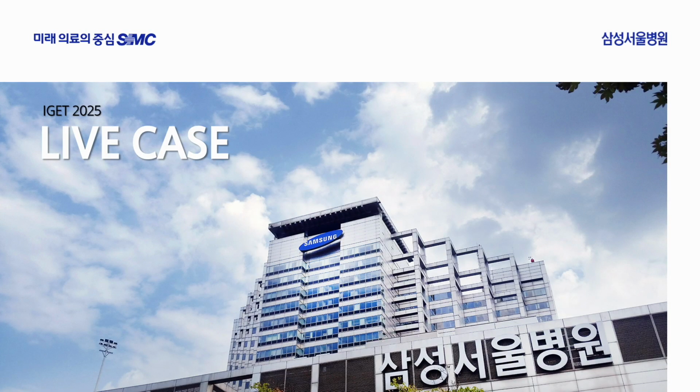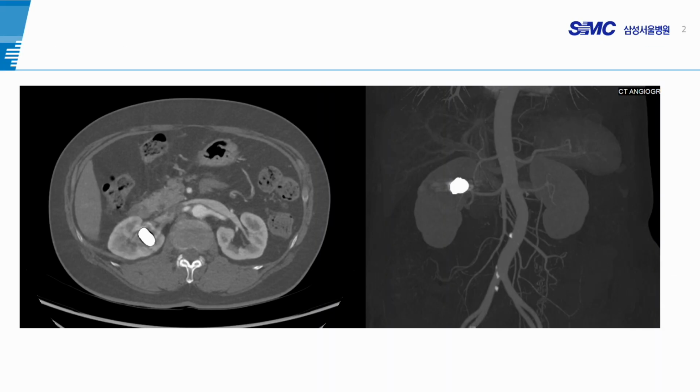One month later, the patient returned to our clinic, and the follow-up CT scan shows a complete resolution of the AVM. The previously visible early draining vein is no longer seen. So that's our result.